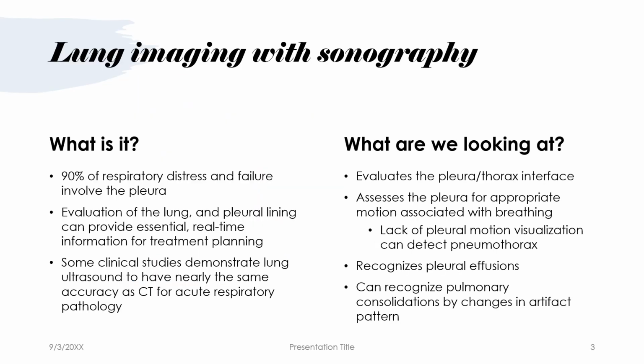Lung imaging with sonography. So what is it? As a sonographer, when I first heard about lung imaging, I was like, that's not possible. Sonographers hate air. Air just disrupts our beam, creates dirty shadows. There's no way this can be real. And so I was a hard sell, but after looking at this and practicing with this, it really is a great opportunity to evaluate the lung, but not in the way that we generally evaluate things with sonography.